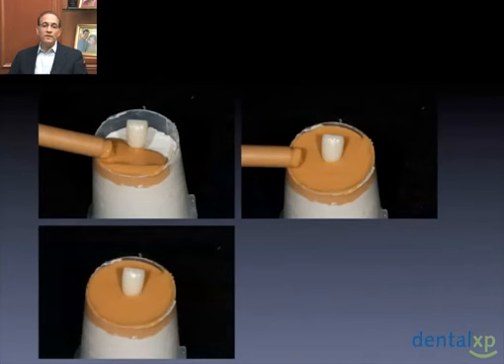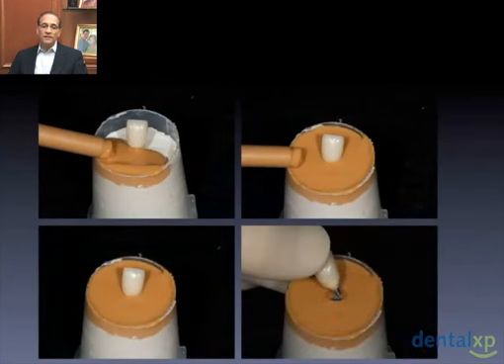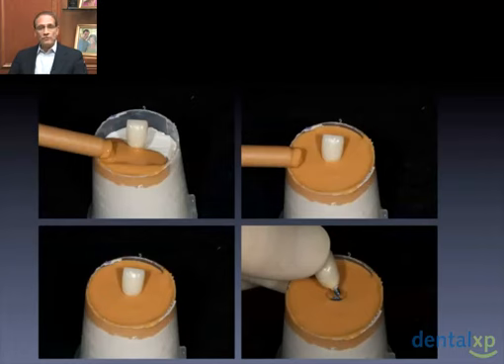Now what this has done with the provisional is that it is captured three-dimensionally in that impression all the subgingival contours of the provisional that we've already created, that's been in the mouth, that's guided the tissue, and has allowed the tissue to heal and grow into the position that we need and want it. So this is a nice way to transfer the information to the dental laboratory.